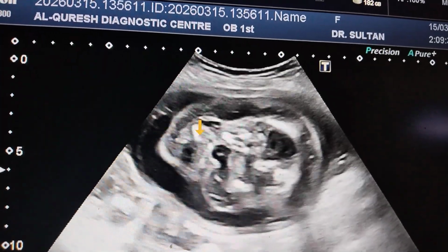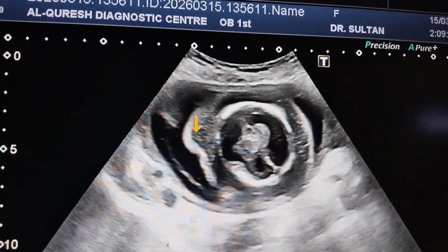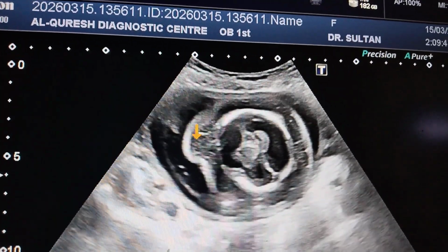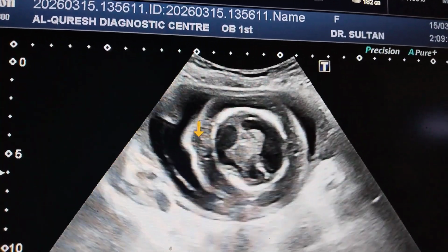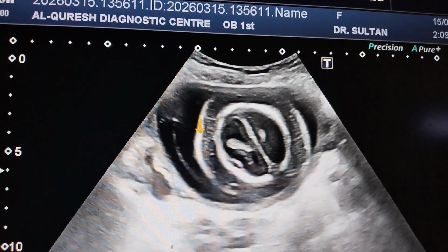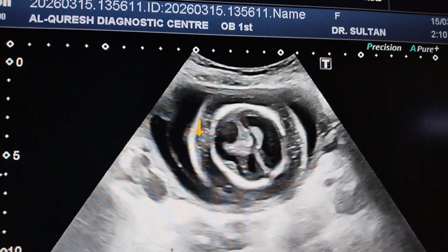So when there is immune hydrops fetalis, we should also check the fetal middle cerebral artery, which will show the high peak systolic velocity. Then we will come to know that the patient is having severe anemia, which is due to the fetal RBC hemolysis. And also then we will ask the patient for the blood grouping.